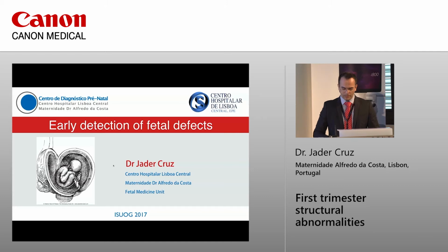I'm going to talk a little bit about early detection of fetal defects, which is another way to say structural abnormalities in the first trimester. And then we will move to a live scan. I think that's the sequence.